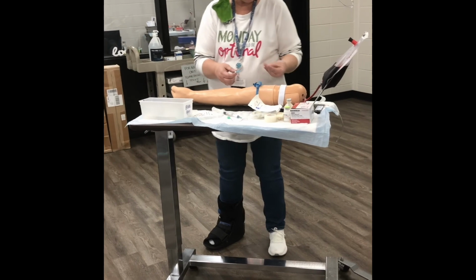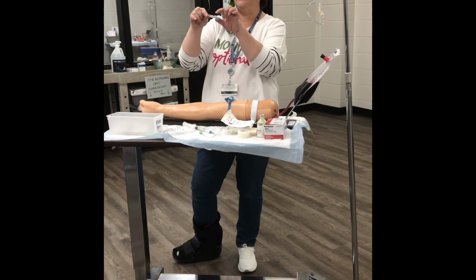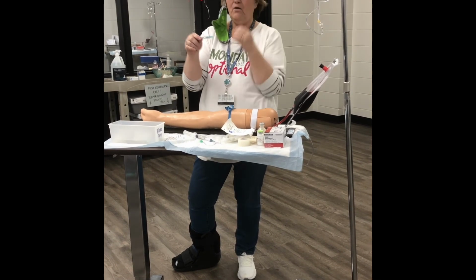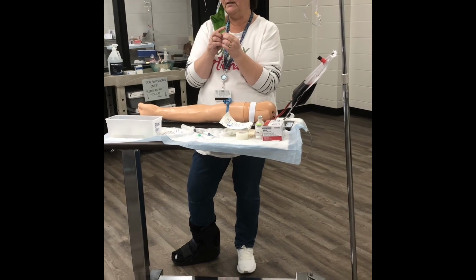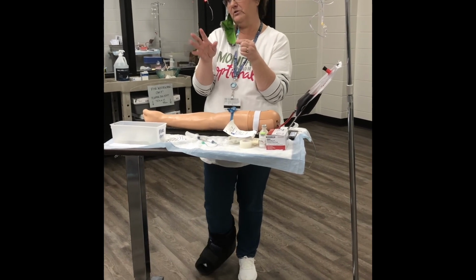Now, let's talk about sticking before I do it. The catheters that we use, if the button's on the top, the bevel is up. But you need to know that you always stick with the bevel up, okay? When you're practicing, do not push the button, because then the needle goes into this little thing and there's no way to get it out. That's why you have about 4 in your bag, because you're going to push the button sometime.